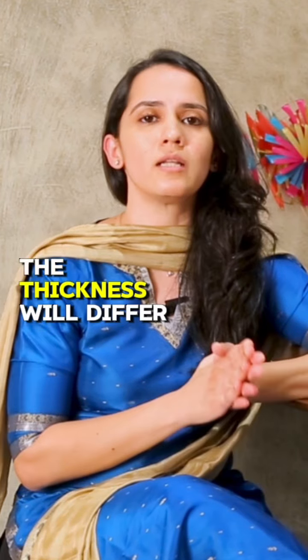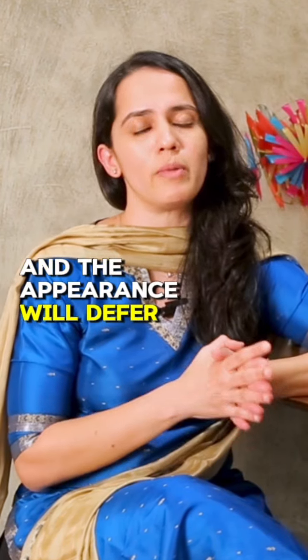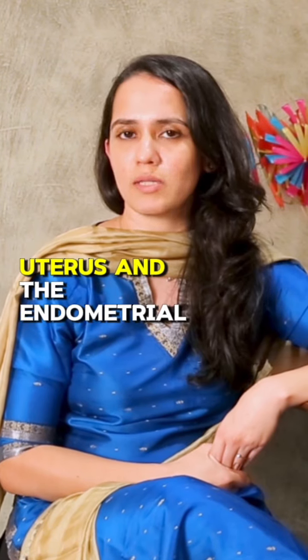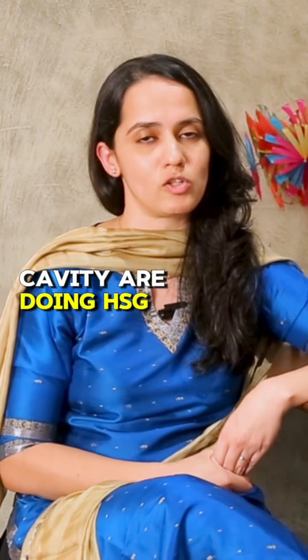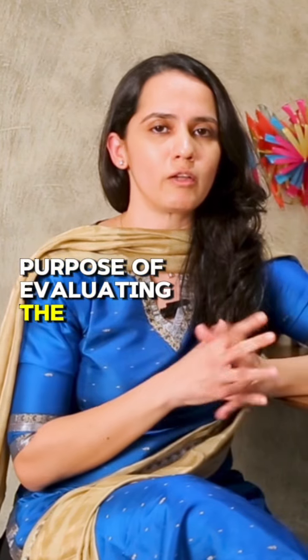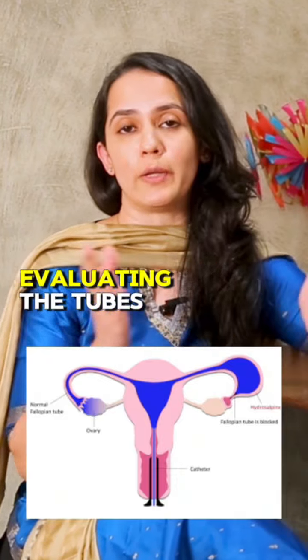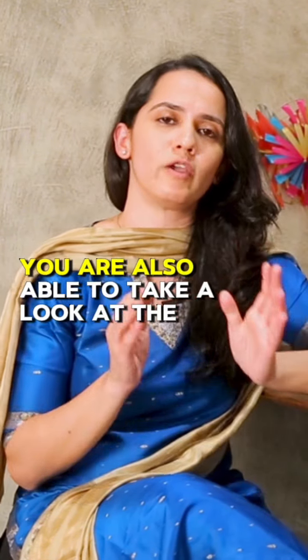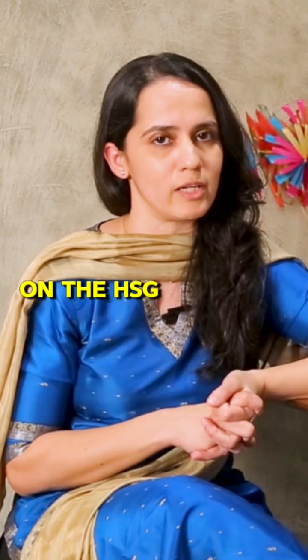Now this lining, the thickness will differ and the appearance will differ based on the day of your cycle. The other ways to evaluate the uterus and the endometrial cavity are doing an HSG. HSG is usually not done for the purpose of evaluating the uterus, but it is done for the purpose of evaluating the tubes. But in addition to being able to evaluate the tubes, we are also able to take a look at the uterus on the HSG.